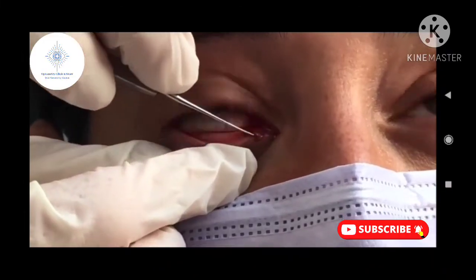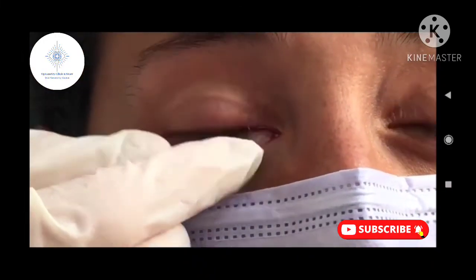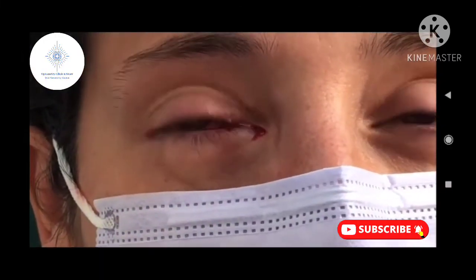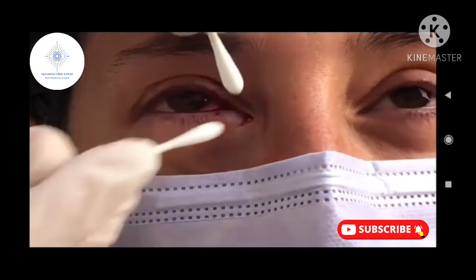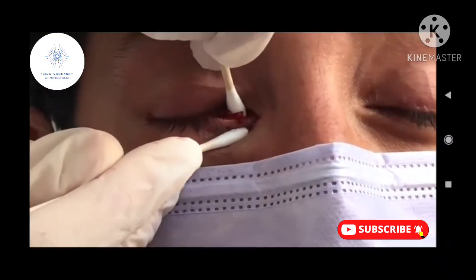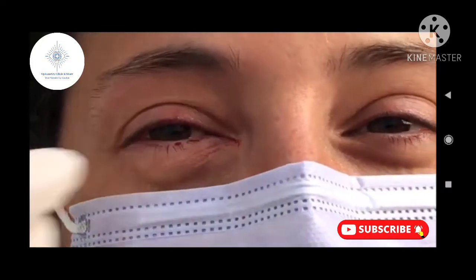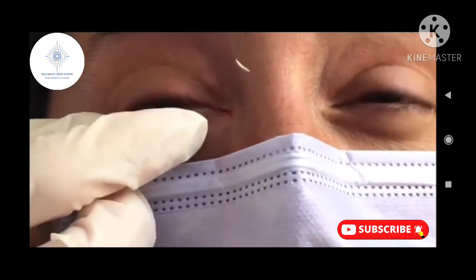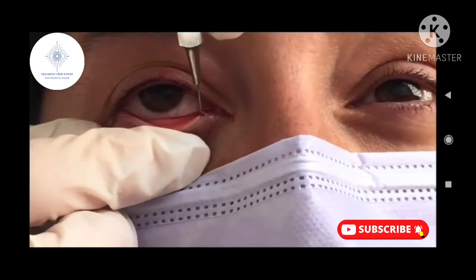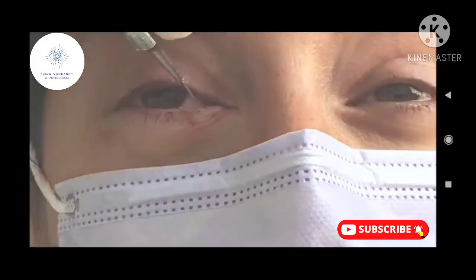Often, a repeat curettage is necessary to truly remove all of the infectious material. Once the material has been completely removed, the lacrimal system can be irrigated with topical antibiotic solution. This is a very safe and effective technique to remove the infection of canaliculitis.